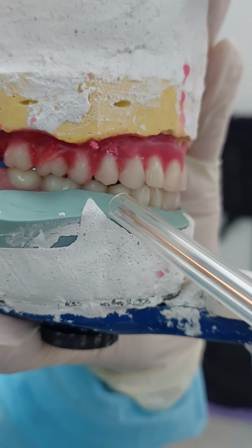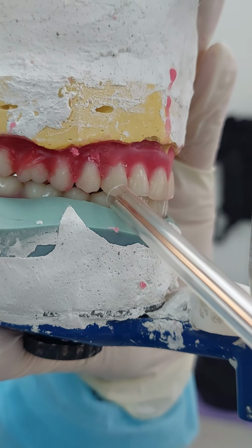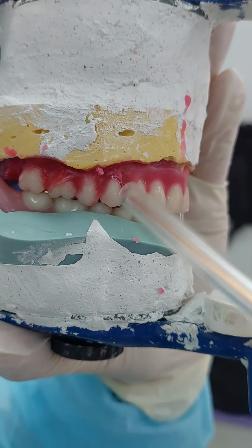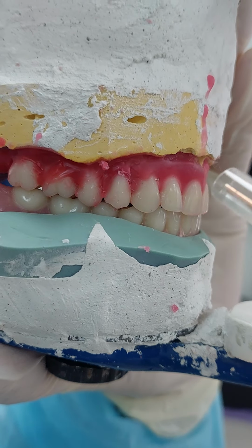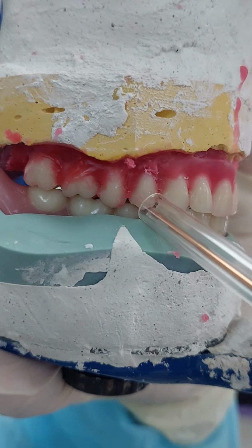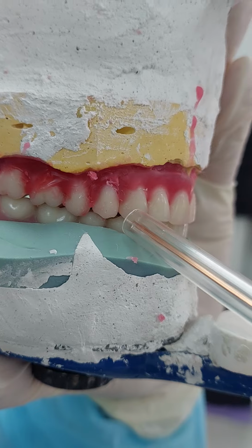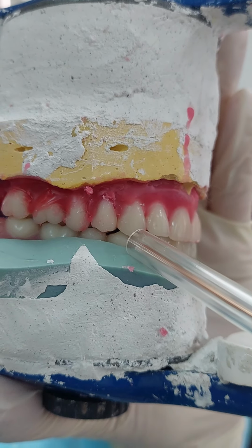While she was sitting, she was asking about this tooth first. Do I put it in between teeth? Yes, the answer is yes, because the embrasure between the two lower teeth protects the cusp, so it will not be high. The ideal position for a tooth is between two marginal ridges of the opposing teeth. So the cusp should meet two opposing marginal ridges. You can reduce the canine a little bit distally and move this into the embrasure correctly to meet the mesial embrasure as well.